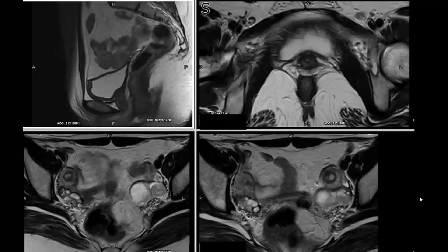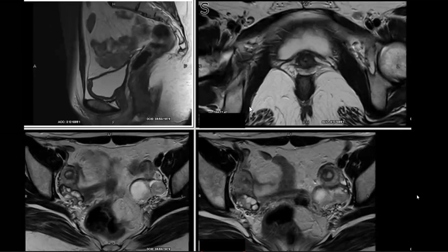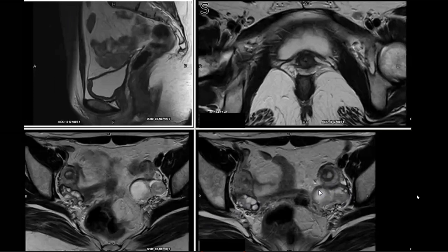Another case with primary amenorrhea — you don't see the vagina or the hypointense wall of the vagina, urethra, or anal opening. On the sagittal section, vagina is absent and the uterus in the midline is not present. But on axial sections, you see one uterine horn and another uterine horn, but they have not fused — two rudimentary uterine horns. This patient had normal-appearing ovaries bilaterally. This is again a case of congenital absence of vagina.